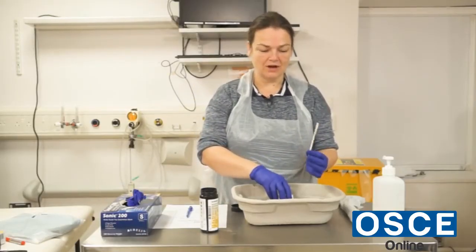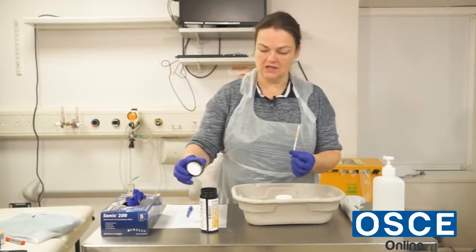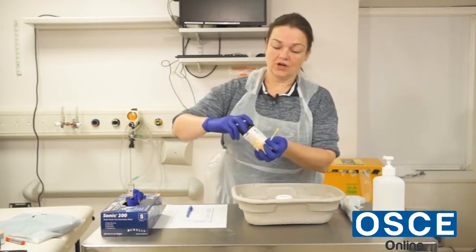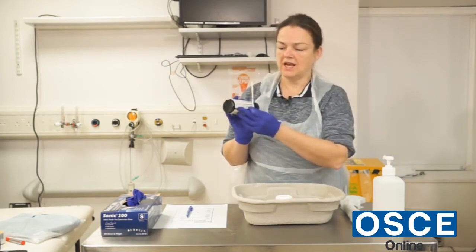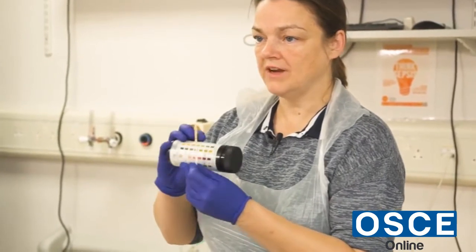And so I'm going to have to do this left-handed and compare it against the numbers or the colours which are numbered on the sample pot. So it goes round in time frames that you have to read.